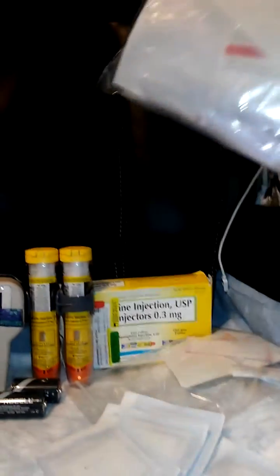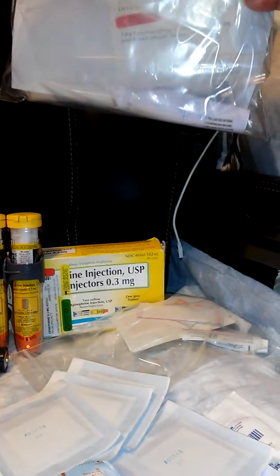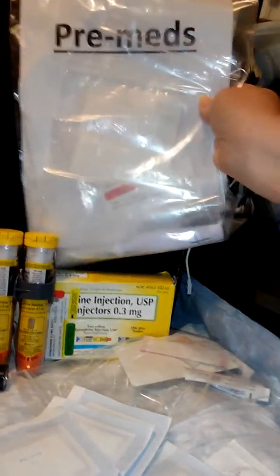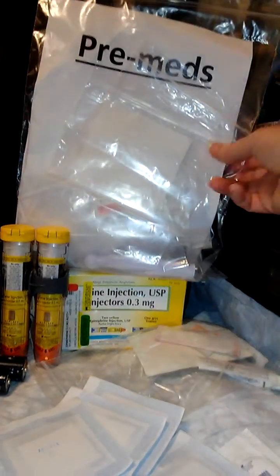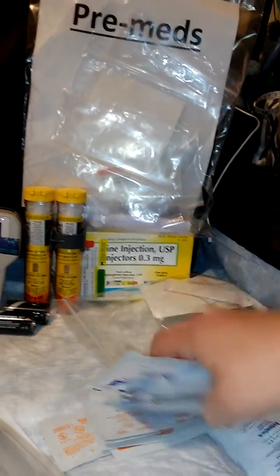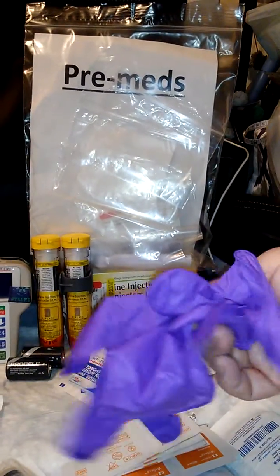I've taken my pre-meds. They came in this bag. I have my very important epinephrine injection, just in case there is a reaction to any of the infusion that I'm getting ready to take. I've already taken my temperature. It is 97.5 tonight. I have my gauze pads here, just a stack here. Got my alcohol preps. Gloves, I do have those.